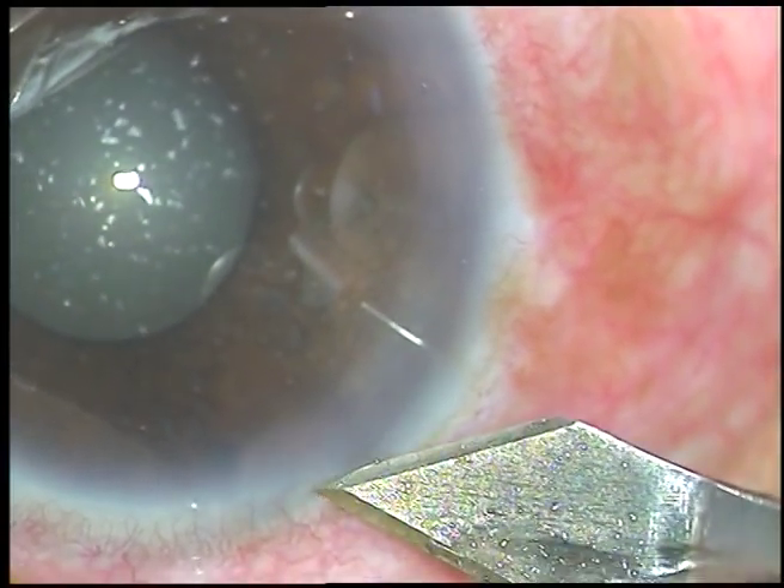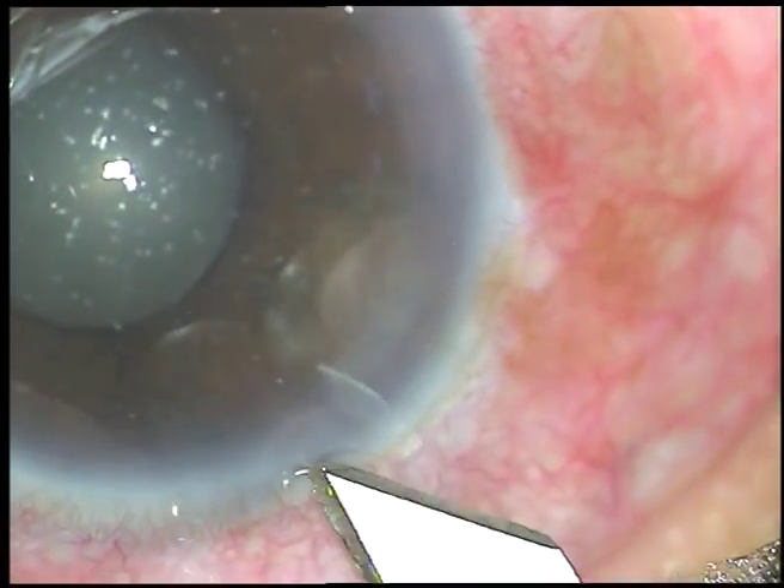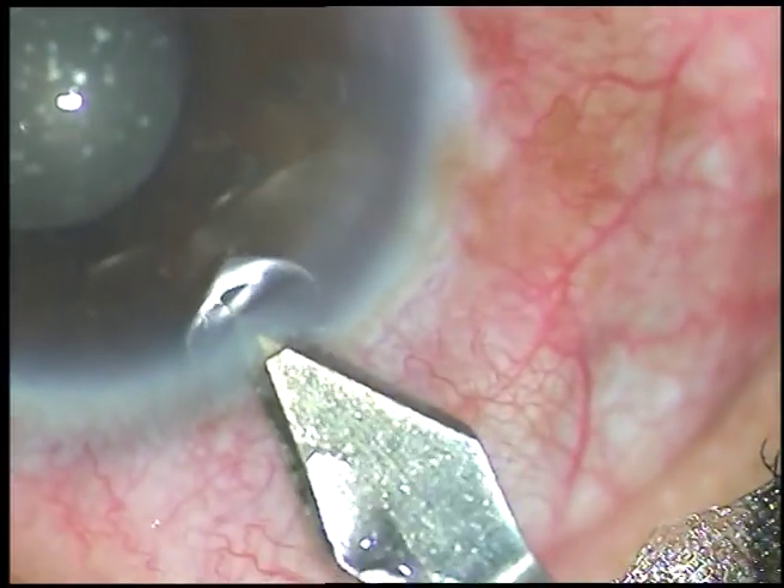Dear colleagues, this patient has come with an acute attack of angle closure glaucoma. I have taken up this case for surgery.